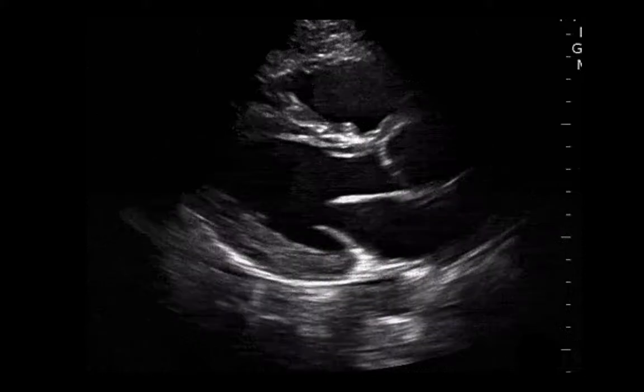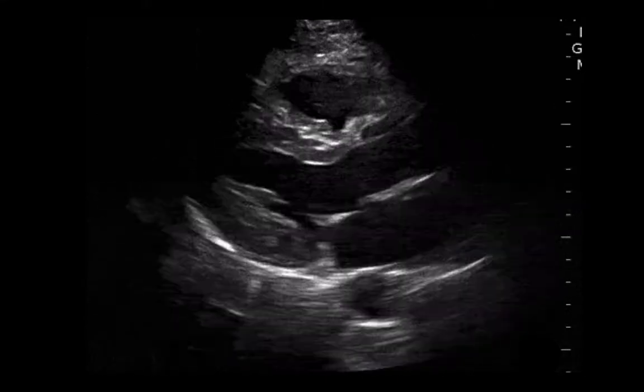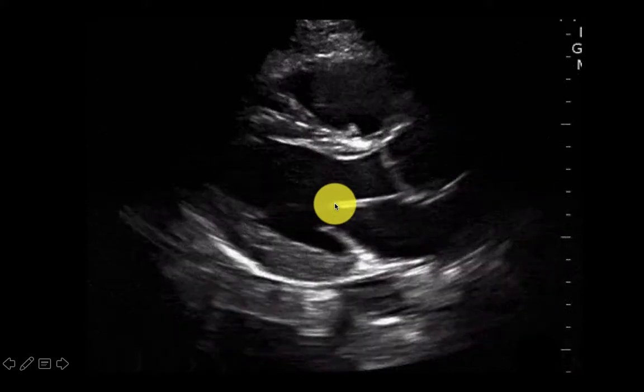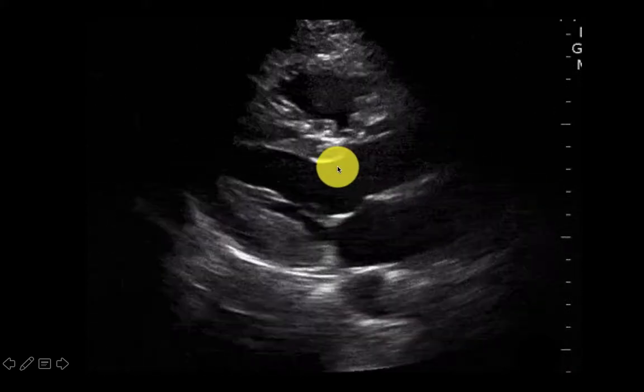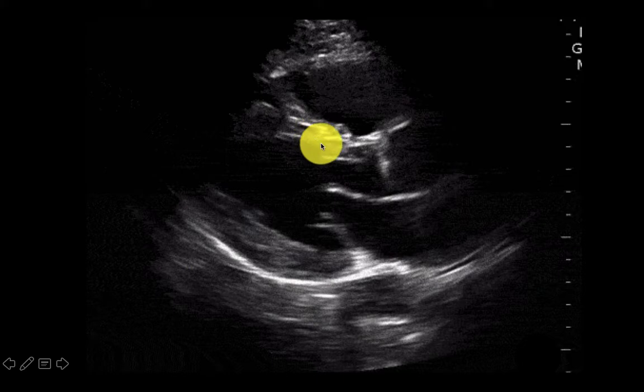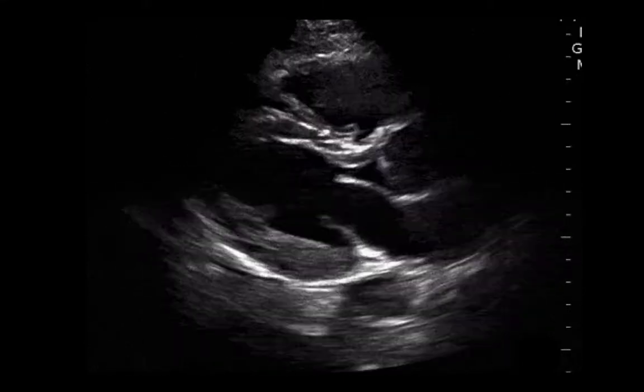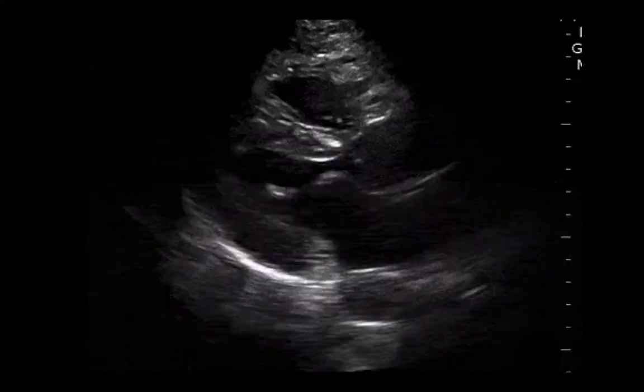The other place to have your eye, and we'll talk about this more in the advanced lecture, is at the anterior tip of the mitral valve, which you see here. With every beat, the tip of the mitral valve should slap, it should high-five the septum, which you see pretty nicely here. But with heart failure comes valvular disease, so I wouldn't hang my hat on that.